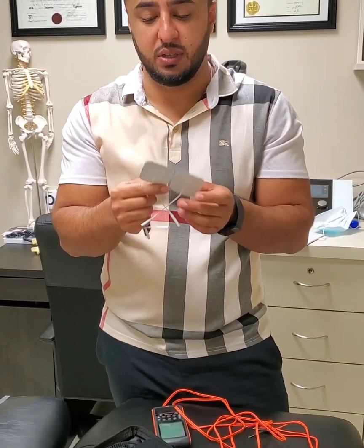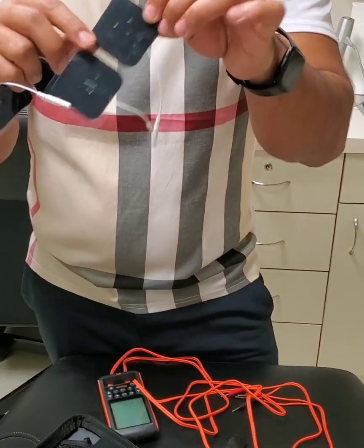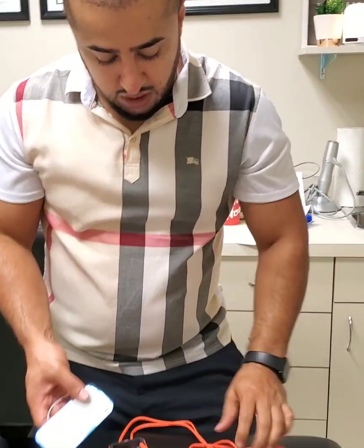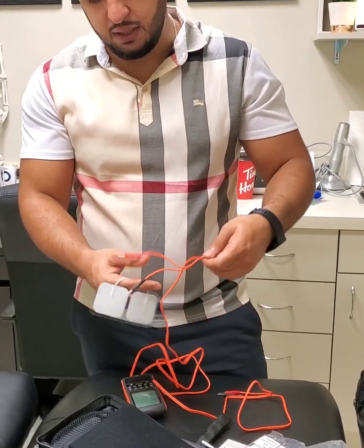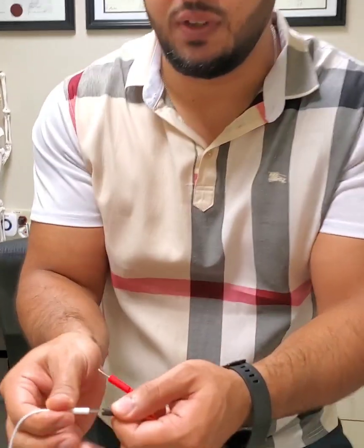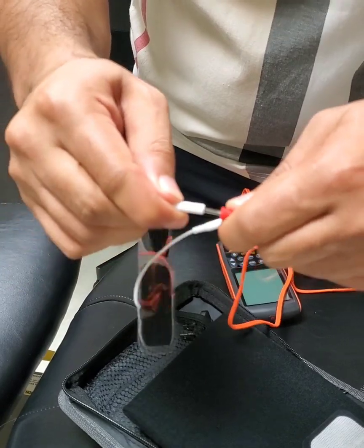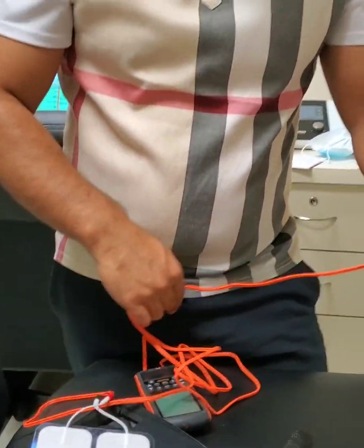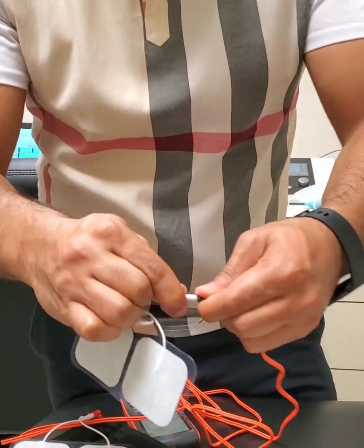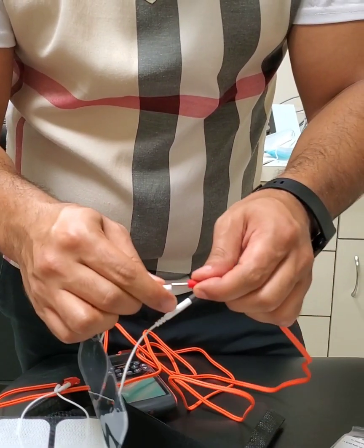If your back is really hairy, it won't stick. Once you're done using it, put it back onto the clear film so that the adhesion doesn't get affected. When connecting them, you're going to connect the electrodes to the end of the wires — it doesn't matter which one you put into which, they're all the same. You can just slide them right in like that, same thing for the next channel. Make sure it goes all the way in.